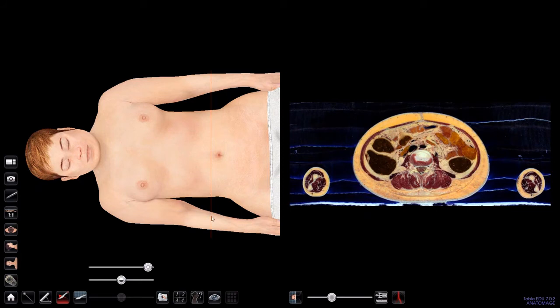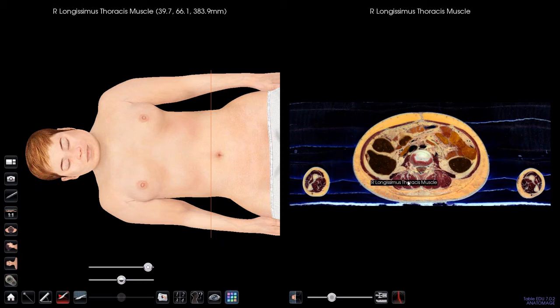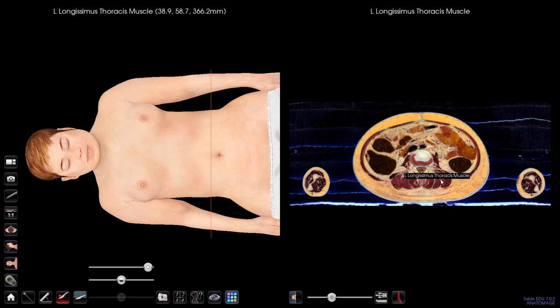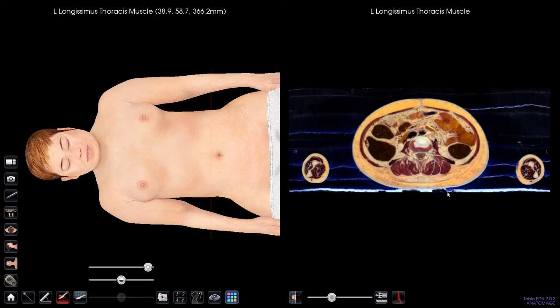You'll actually see an orange box appear up here — this is the slice that we're in. If you've ever heard of an MRI slice or CT slice, it's the 2D cross section that is representative of the 3D whole. You can select things in the 2D image and it will outline them. What we're going to do is dig through this body to find particular features. Each one of these slices is sub-millimeter — extremely high resolution. The real color actually lends better boundaries than most other technologies, giving you both better resolution and the added benefit of color that you lose with MRI and CT.